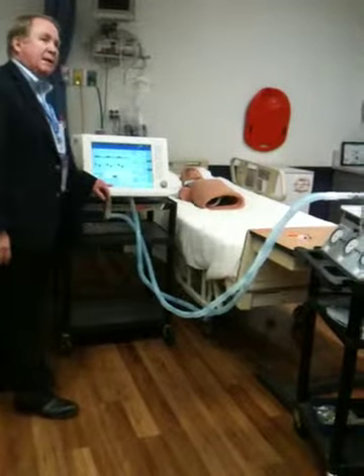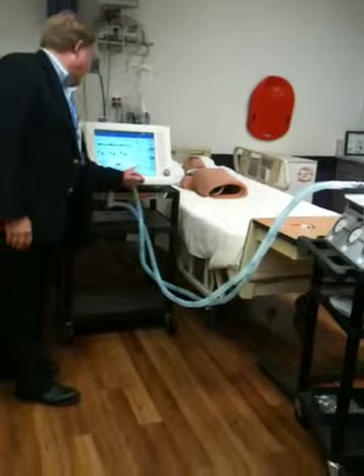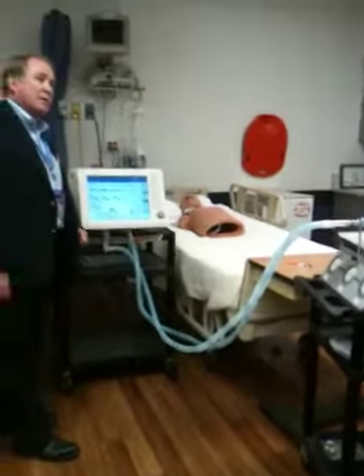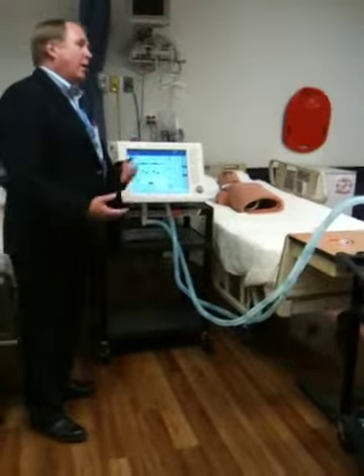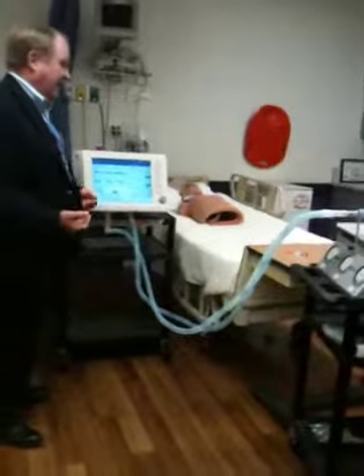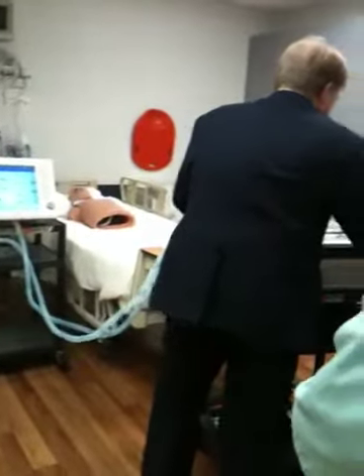compliance is only 18 at this lower portion. So my compliance improves as it went up the curve, and then the center portion of it stays pretty constant all the way through. We want to ventilate our patients in that center portion of it. Patients with ARDS have lungs that look more like this.